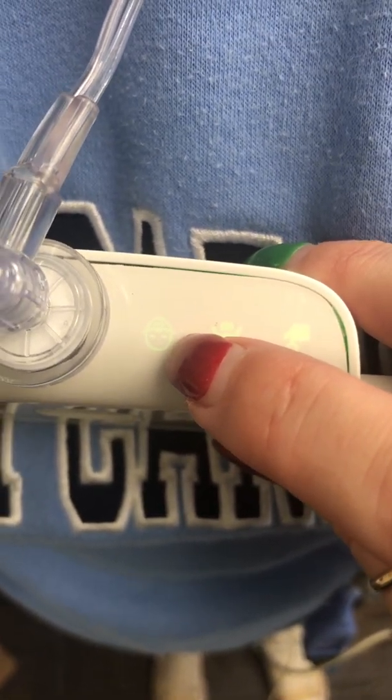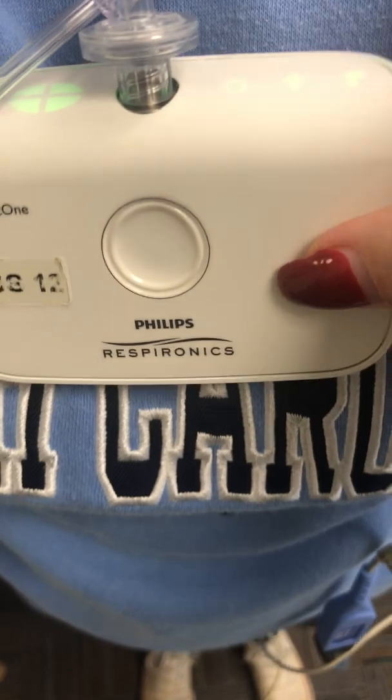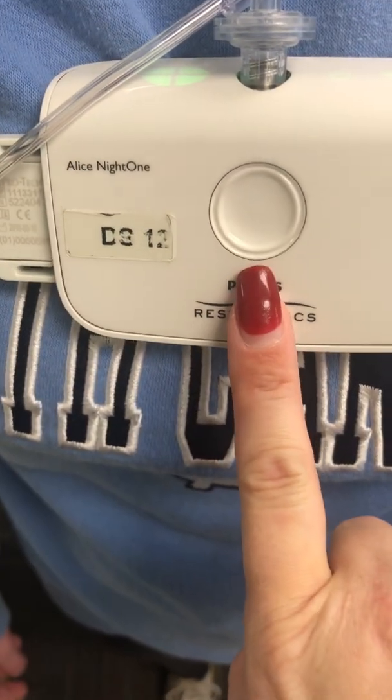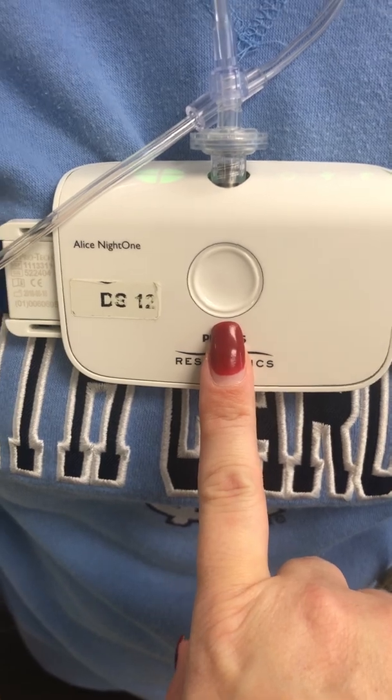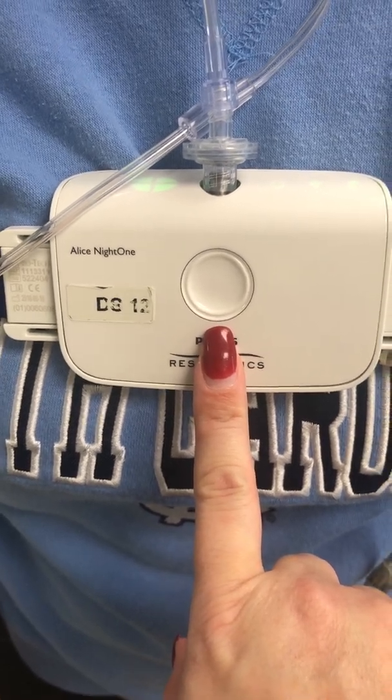Just secure that item and continue with the test. Please do not hit the center button — despite what the instructions say, we have found that this causes errors with the device.